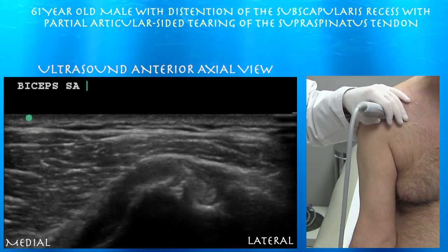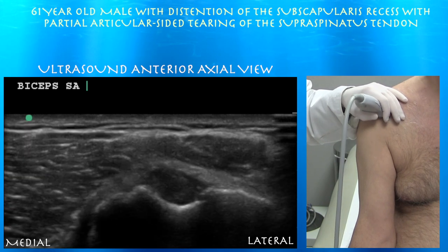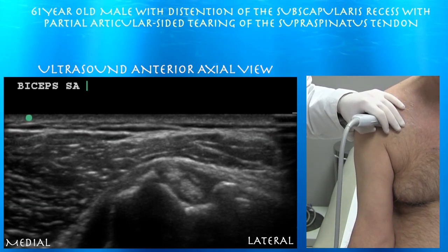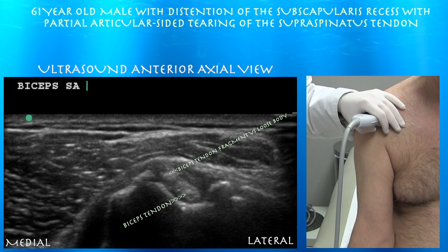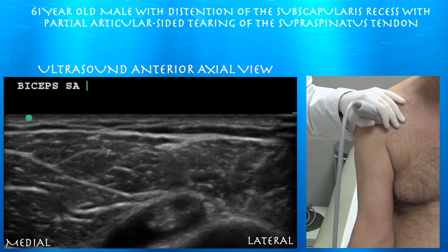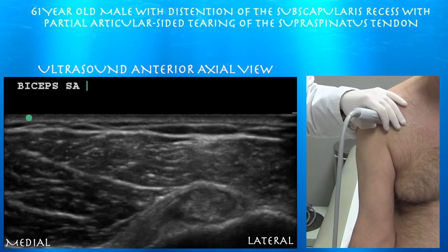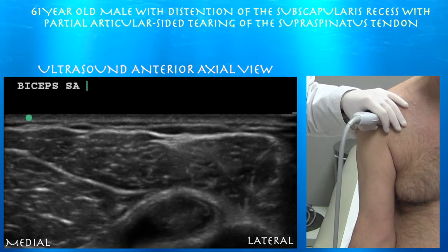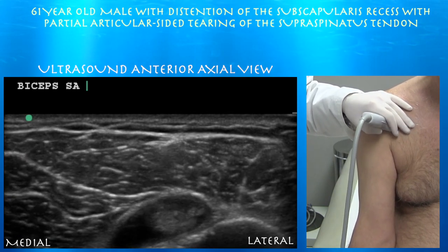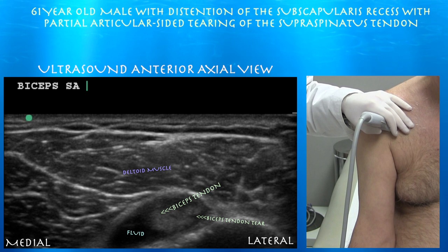Left side of the screen is medial. We're looking at the biceps tendon. Here I think is a split in the proximal biceps tendon. Sometimes you can get loose bodies in the bicipital sheath, which may be present here as well. Certainly here you can see a larger effusion, and you can kind of make out those partial tears.